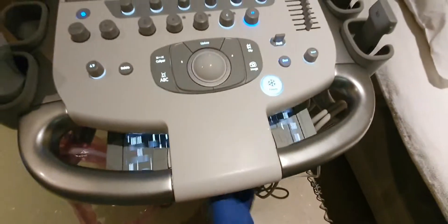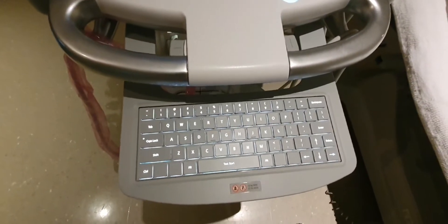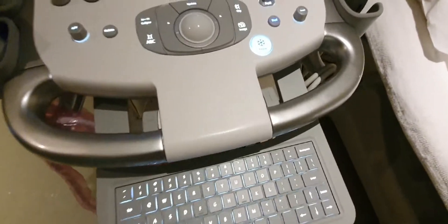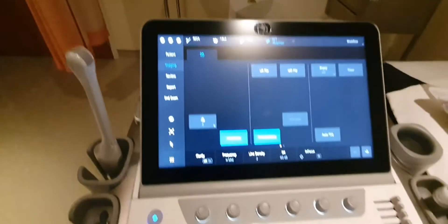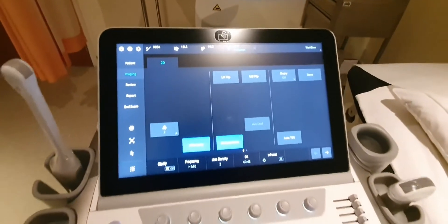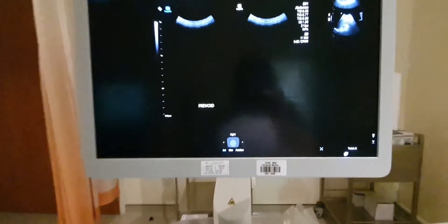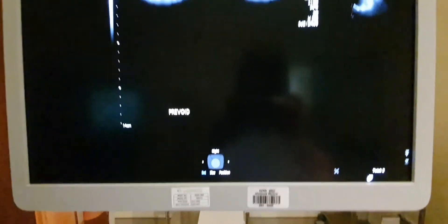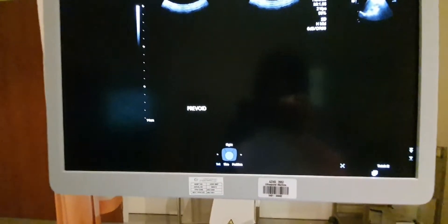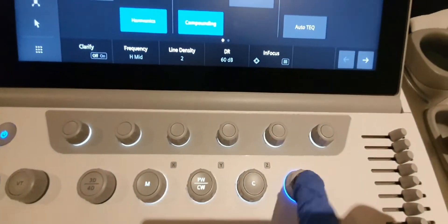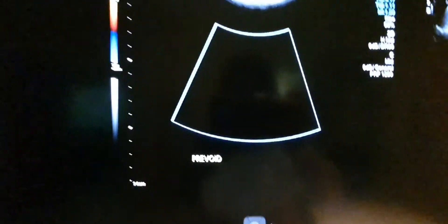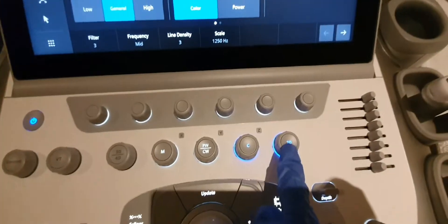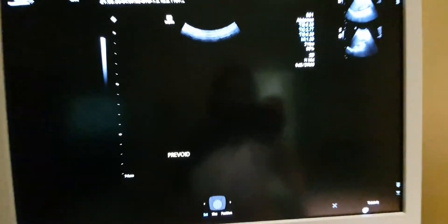Let me wipe off the gel. One more thing: if you want to return to a single screen from dual mode, just press the 2D button. Also, if you want to remove the color Doppler overlay, just press 2D again. That's basically the overview of the main buttons and functions on this Siemens ultrasound machine.